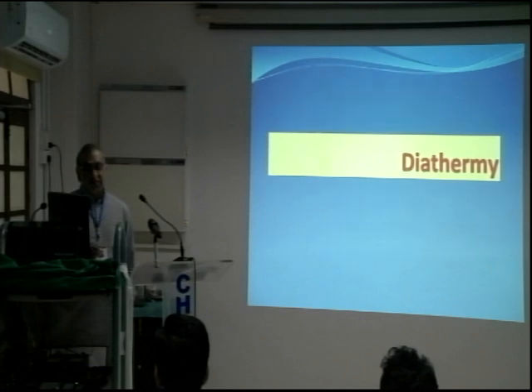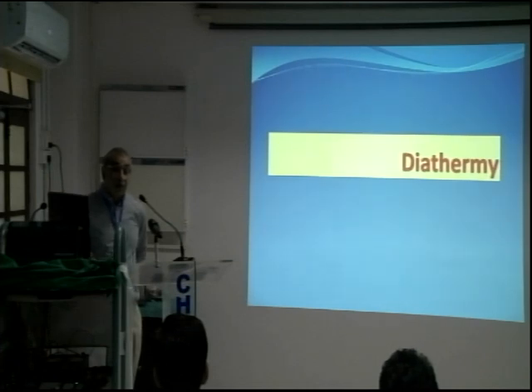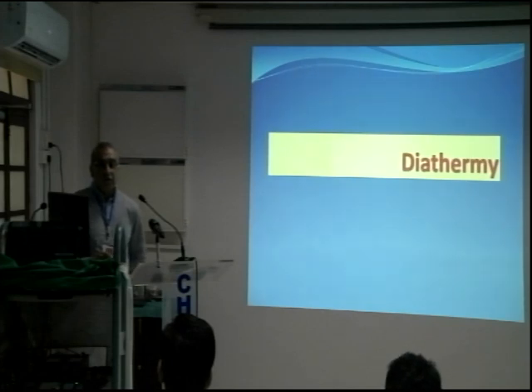So for a lot of things, मतलब colonoscopy तो आप बगैर sedation भी easily कर सकते हैं. सिर्फ ये है कि आपका टेक्निक अच्छा हो, एयर ज़्यादा ना डालें, लूप्स ना बनाएं. आजकल हमारे पास routinely we have got the scope right. सबसे ज़्यादा जो कोलोनोस्कोपी में चक्कर है वो है उसका एयर इंसफलेशन.